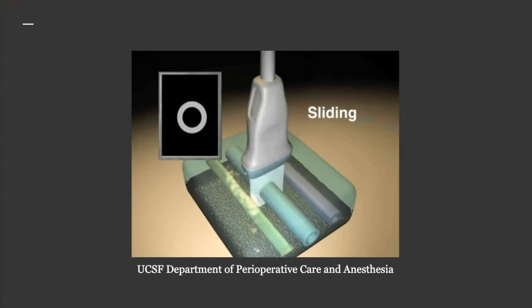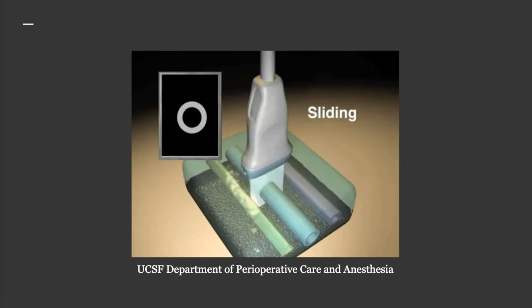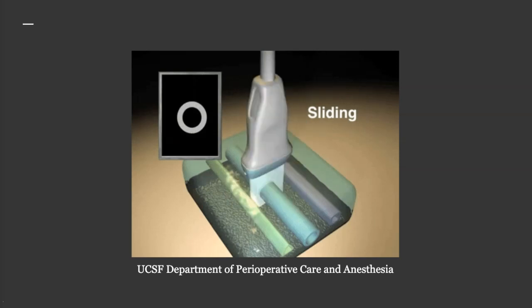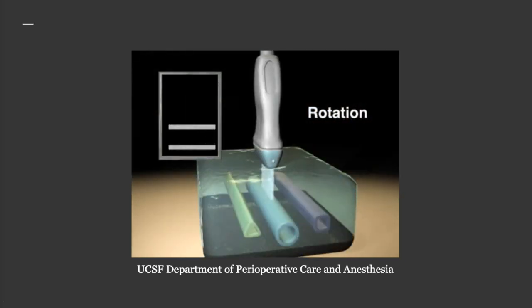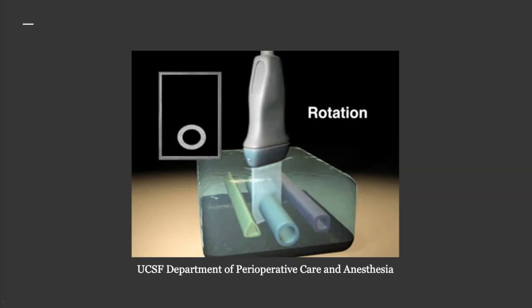I always tell patients that I'm looking for black holes on the screen. As you slide the probe up and down the arm, you're holding the probe perpendicular to the lie of the vein, and that corresponds to a circle on the screen. You can also rotate the probe so it is parallel to the veins, and that changes how it looks on the screen.